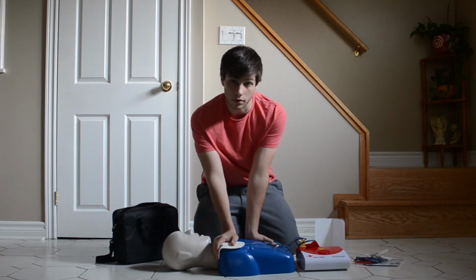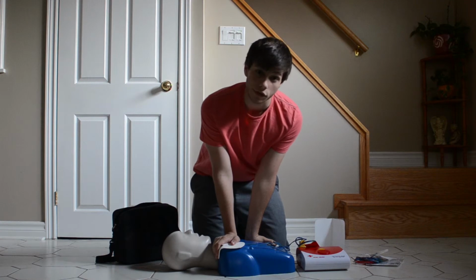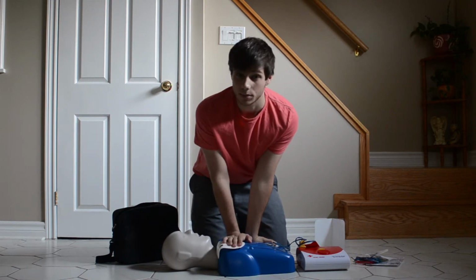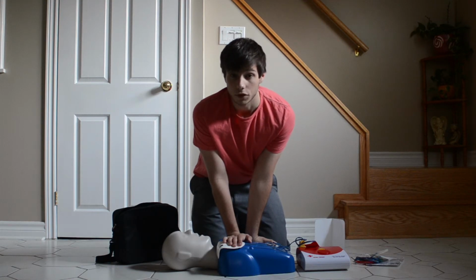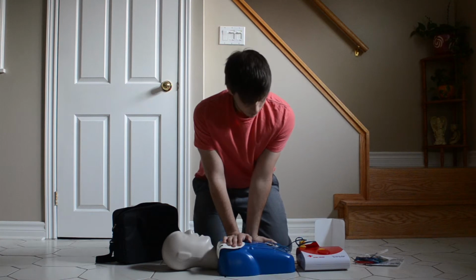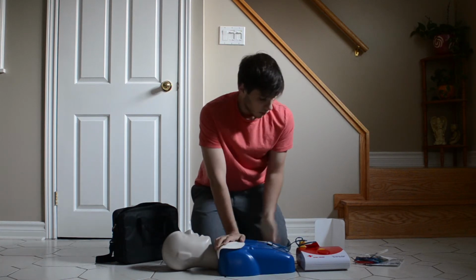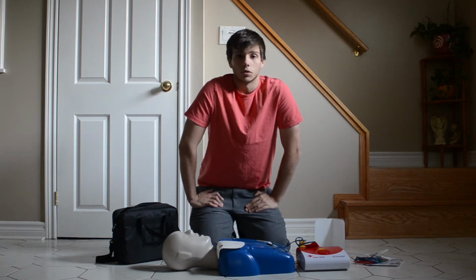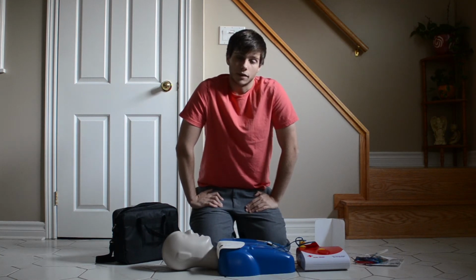Okay, now that my pads are on, another thing to mention: if they have any hair on their chest, there's going to be a razor blade in the first aid kit. You want to make sure you get rid of any hair so the pads have direct contact with the skin. Then you want to turn on your AED. When you turn it on, it's going to be talking to you. It's going to say, analyzing, please step back from patient.